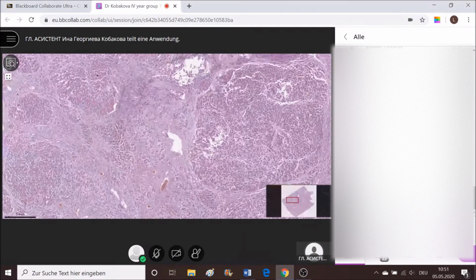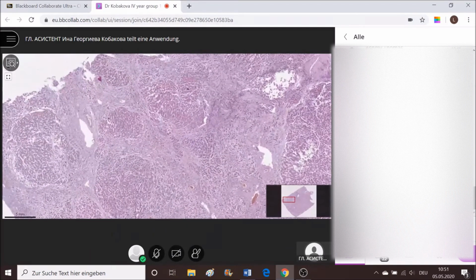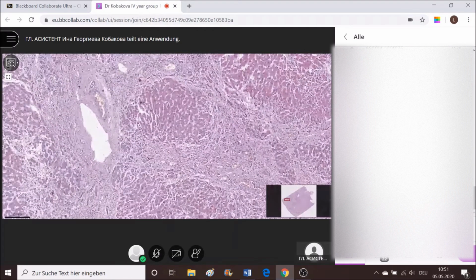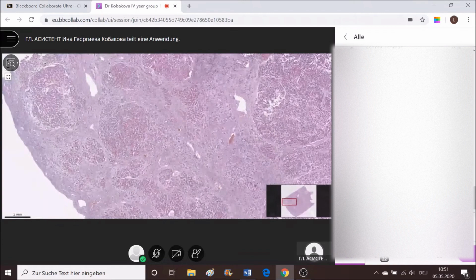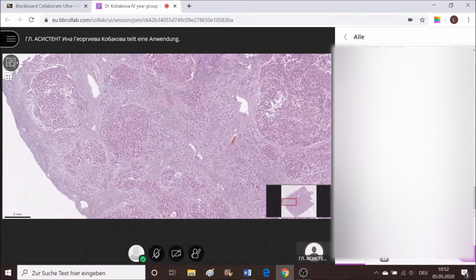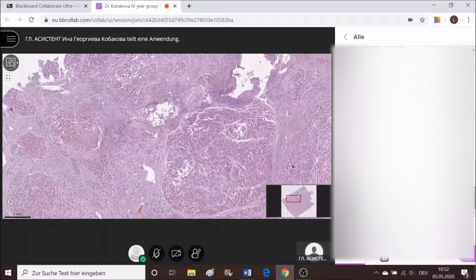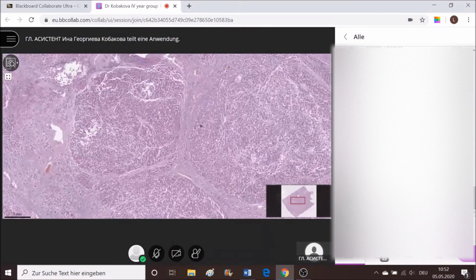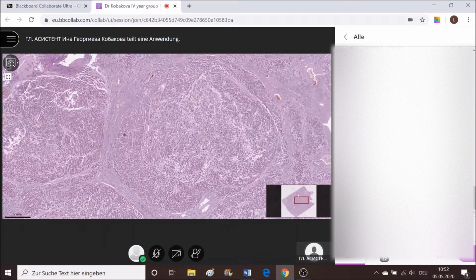Usually they're next to the portal tract, and they are pushed to produce more collagen, like here. And also they start to grow and merge with neighbor fiber strands from neighbor portal tracts, finally forming these regenerative nodules. Centrally positioned, these could be central veins sometimes, could not be at others, but the function of these hepatocytes here is completely lost because there is no normal leakage of blood from the portal tracts to the central veins.